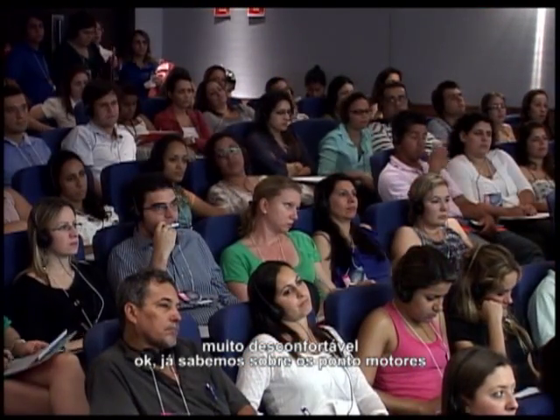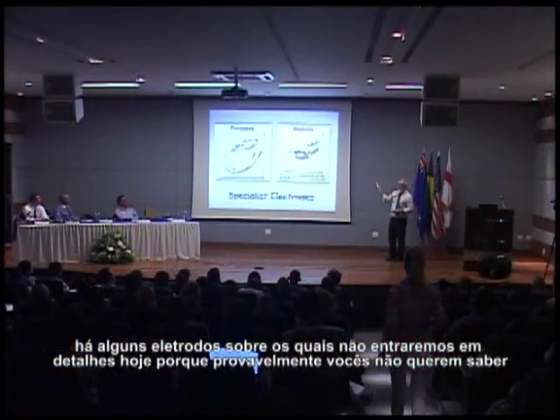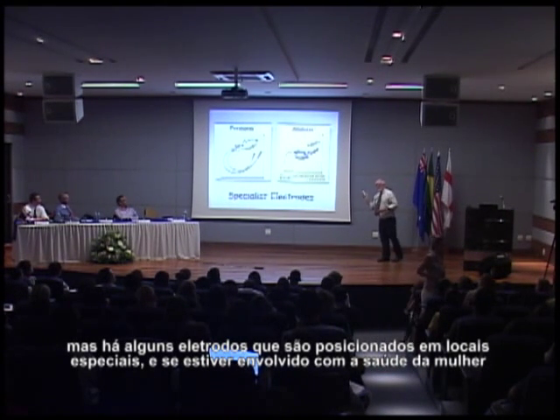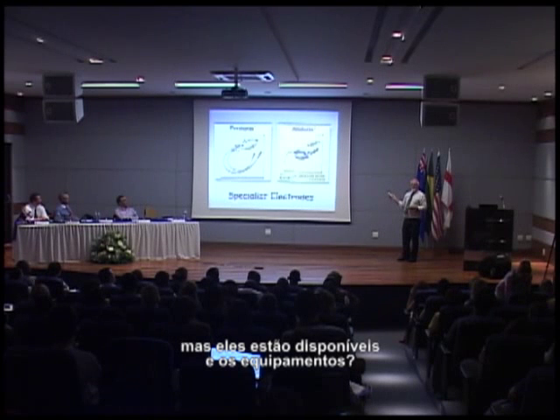So we know about the motor points. There are some electrodes that go in special places, and we won't do any detail here today because you probably don't want to know, but if you are involved in women's health, you know all about those, and we'll look at them very briefly later, but they're available.